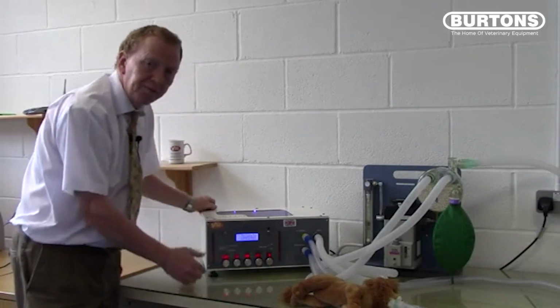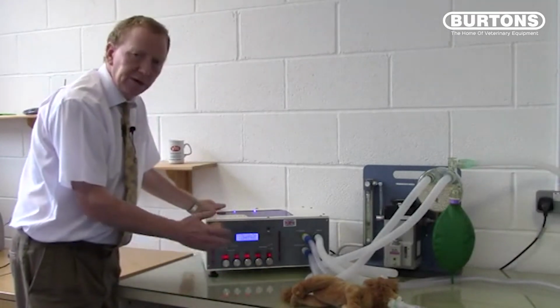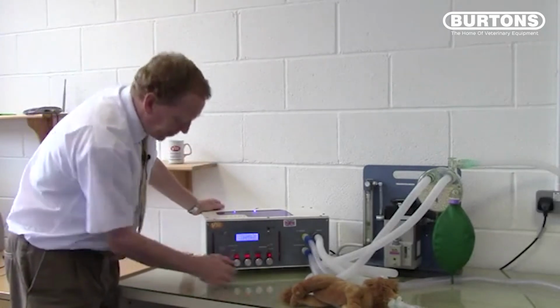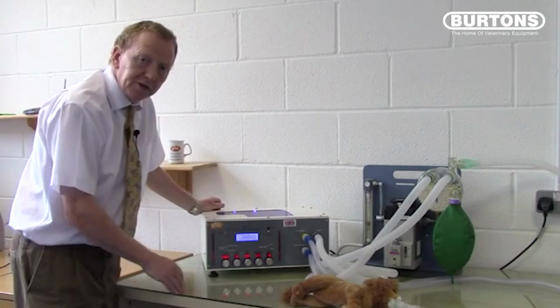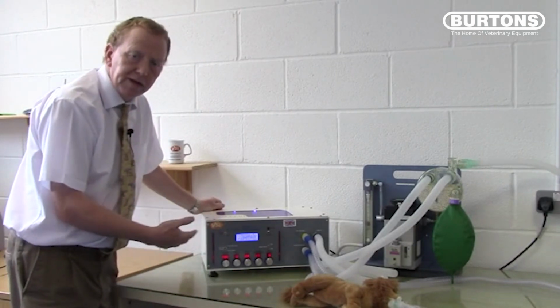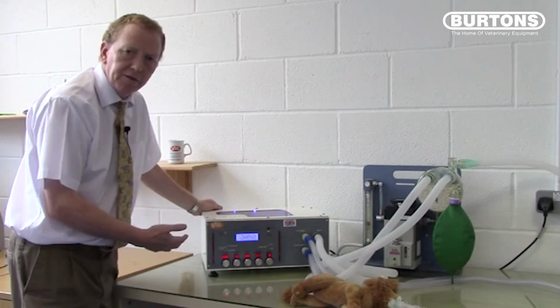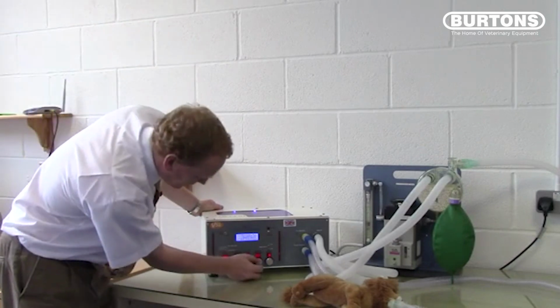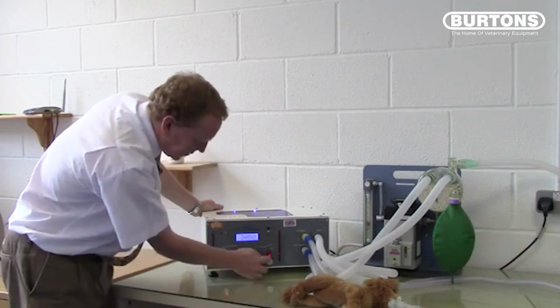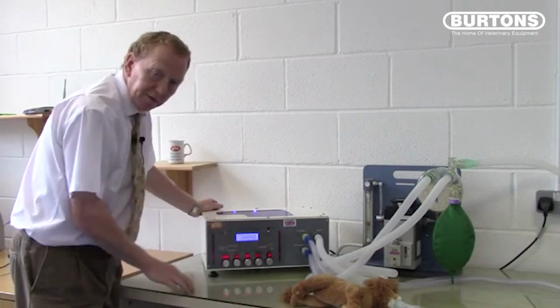The expiratory time, we want an IE ratio initially of greater than 1 to 2, so I would set it between 2 and 3. At the moment it's set to 2.8, which is fine. Our maximum airway pressure is, as described before, a safety circuit limit, and we'll leave this at roughly 5 to 10 centimeters above our anticipated maximum, which will probably be about 15. So we'll set this at 25. And the assist mode threshold is not important in this setting, as the assist mode will be off.